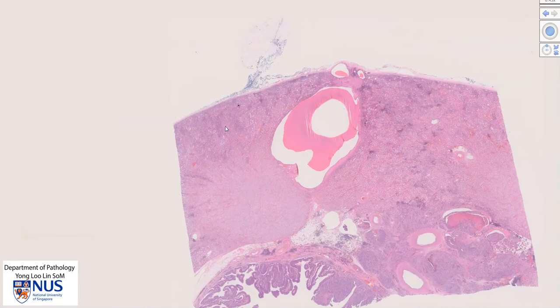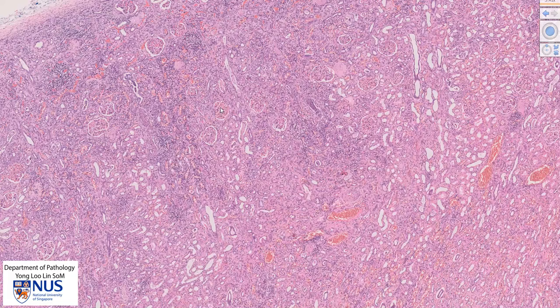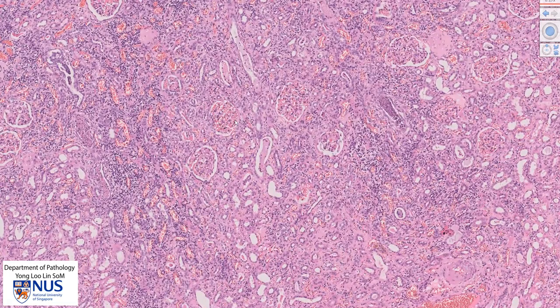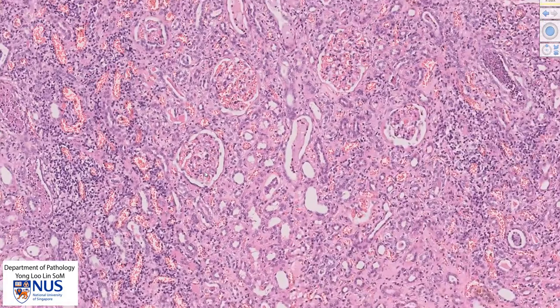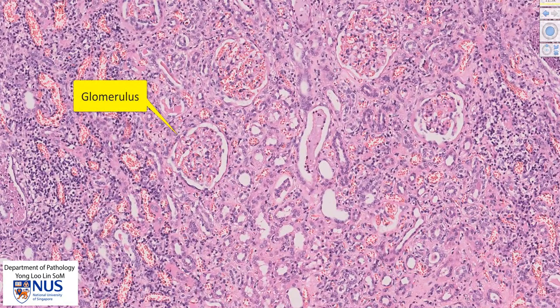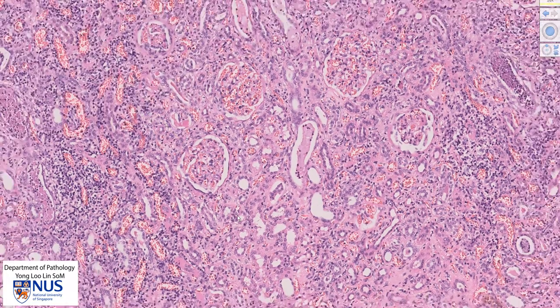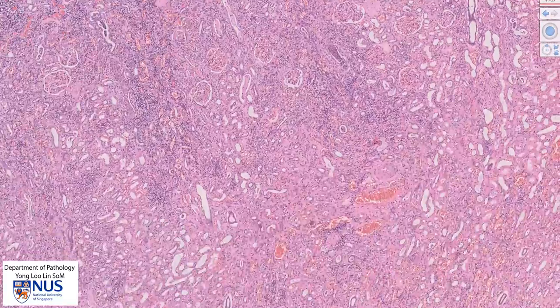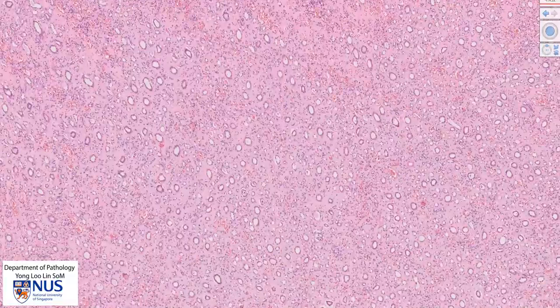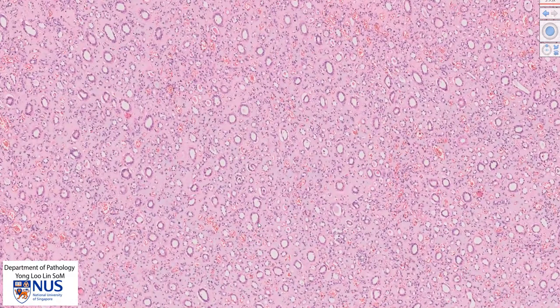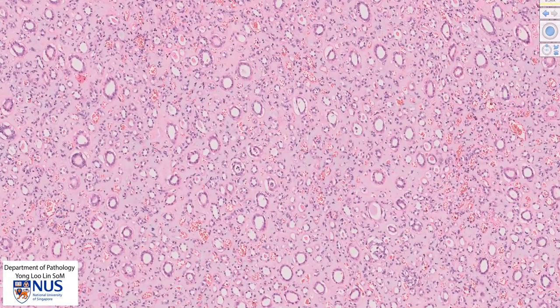Let's have a very quick recap of normal renal histology. Here in the renal cortex, we can see these rounded glomerular structures which are composed of very thin-walled capillaries, and surrounding this we can see some tubules — these are parts of the proximal convoluted tubules. Over here in the renal medulla, we see a different picture, mostly that of tubular structures with some intervening stroma and blood vessels. These are parts of the collecting ducts as well as the loops of Henle.